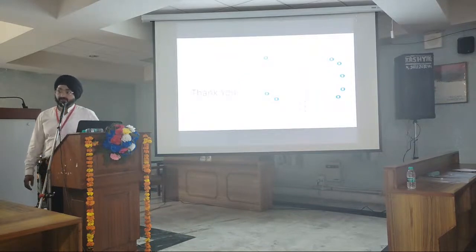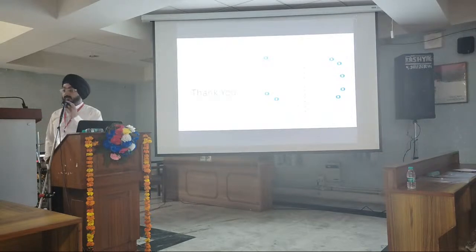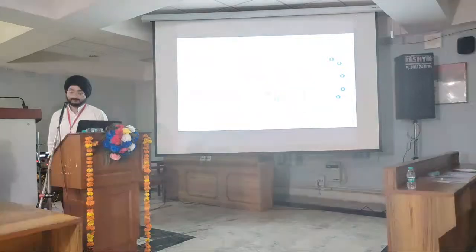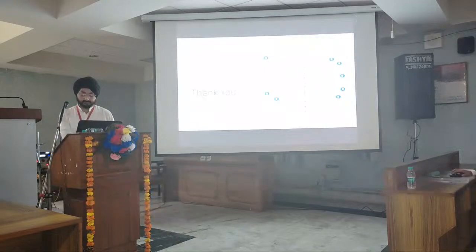Yes, sir. With PET MR, which is going to come to the market and is already available in some centers, it is going to replace the MRI which we are doing immediately followed by PSMA, and PET MRI will take over and be the main staging modality. Yes, that will be the investigation of choice in that case. And it is a metastatic and diagnostic modality when we are not able to say what it is, biochemical markers are high, or when we have an equivocal finding on conventional imaging, then we can do it.